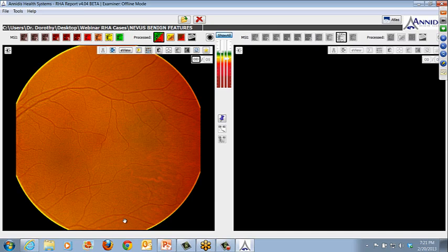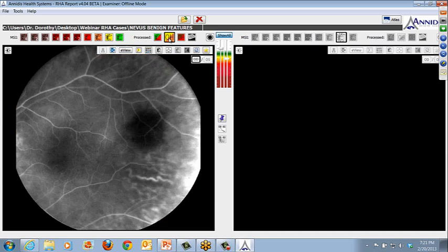So overlying lipofuscin, definitely higher association with conversion to melanoma or the lesion itself being melanoma. Okay, so lipofuscin borders. Drusen is actually a sign of senescence of the lesion. It indicates that it's actually been around for a while. So drusen are not necessarily a bad thing, but they're also a way to follow changes in the lesion.